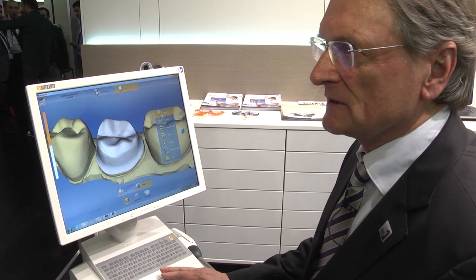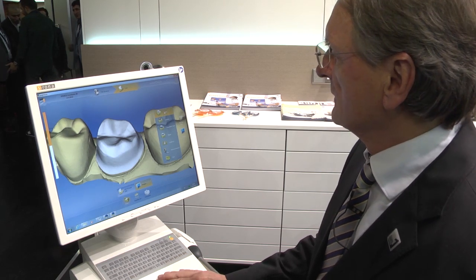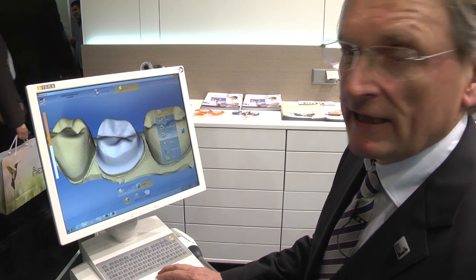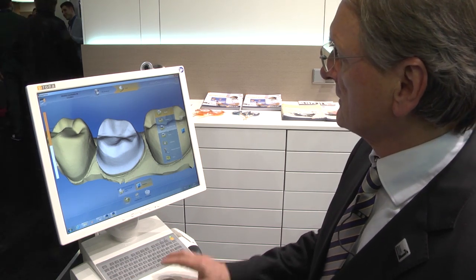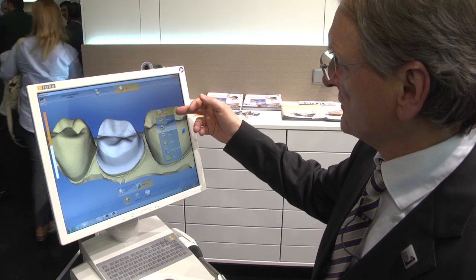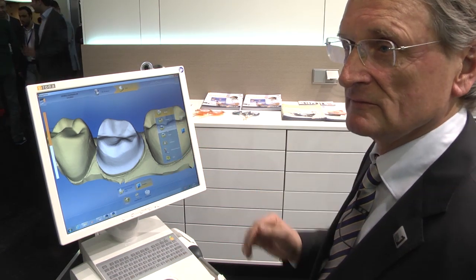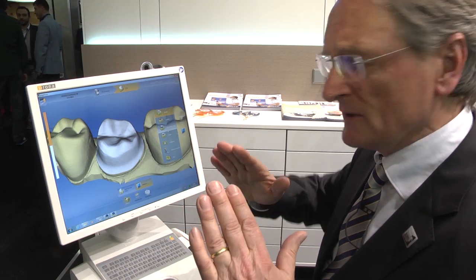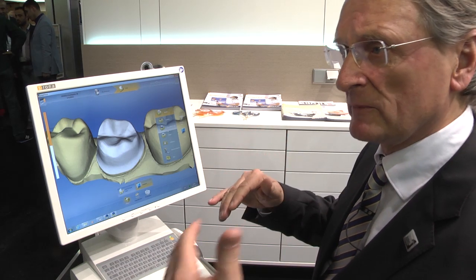Now I've opened PrepCheck and I see my own preparation. I see a crown — it looks perfect here. If I want to see the angle, I can go for the angle. I can go for preparation type, the surfaces, undercuts. I can measure the distance, the taper, and the heights to the antagonist or to the preparation floor.